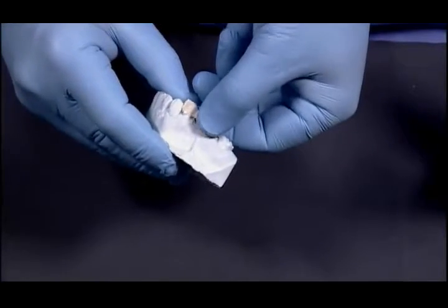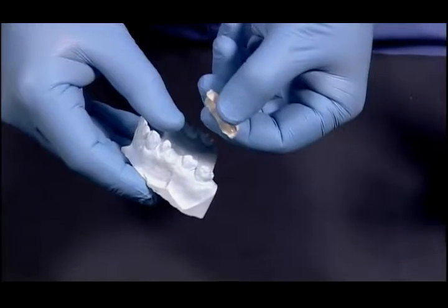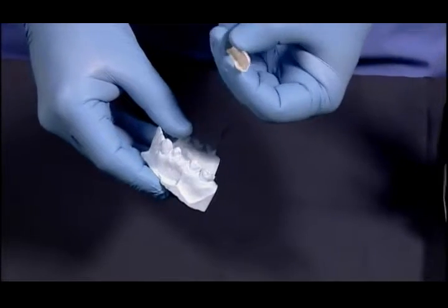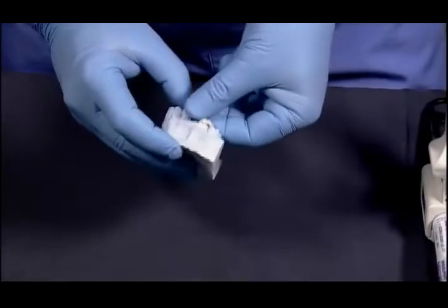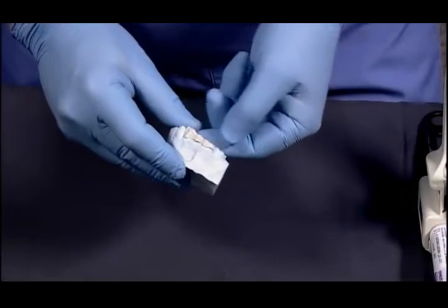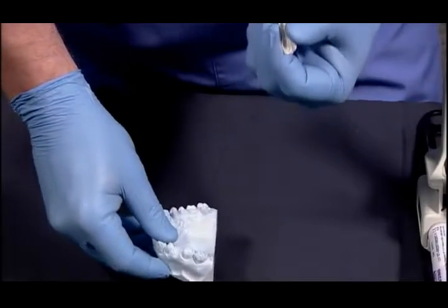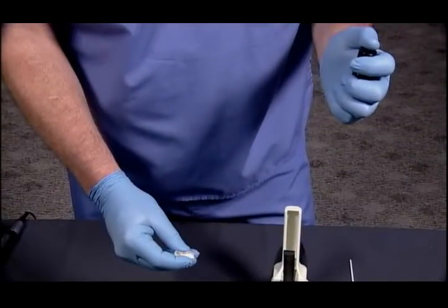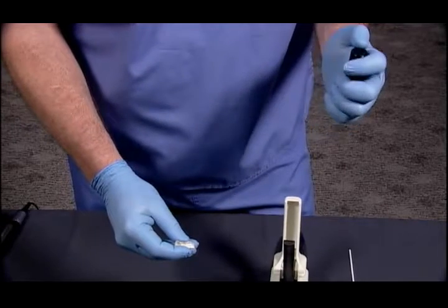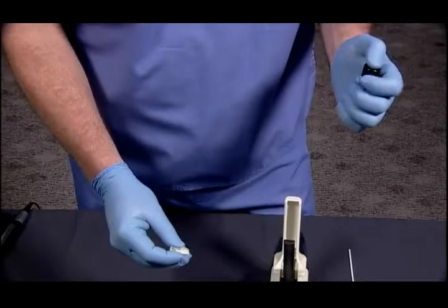And at this point, we will decide whether we're going to be utilizing a technique with either a Bis Acryl liner or with an acrylic lined shell. So for this first case, I am going to be using a Bis Acryl liner within this temporary polycarbonate crown shell. In order to use the Bis Acryl material, first of all, there are many Bis Acryls on the market, but you're going to be using a dual syringe Bis Acryl material.